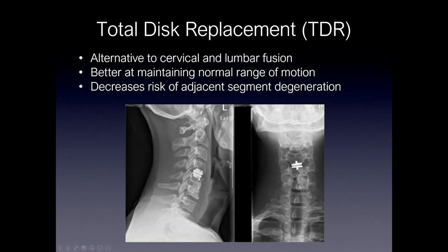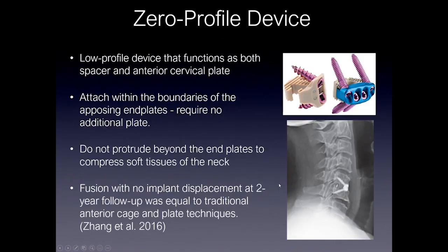Here's an example on imaging of what a total disc replacement appears like — this is in the cervical spine, and here's an example in the lumbar spine. Zero-profile devices are low-profile devices that function as both the spacer and the anterior cervical plate. You can see the pseudo-anterior plate here with screws that go into the vertebral body. The spacer enters into the disc space after the discectomy and can be filled with bone graft material. These do not protrude beyond the anterior margin of the disc space, so they don't press on the soft tissues or esophagus as an anterior plate would, and they show equal rates of fusion compared to anterior cages and plate techniques.